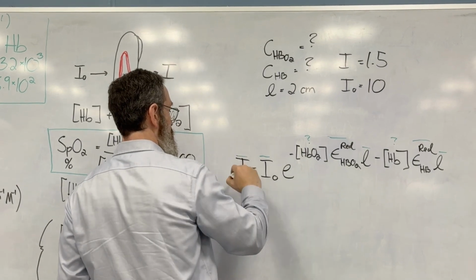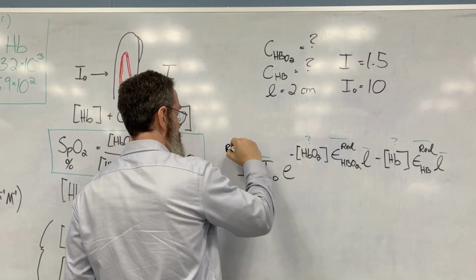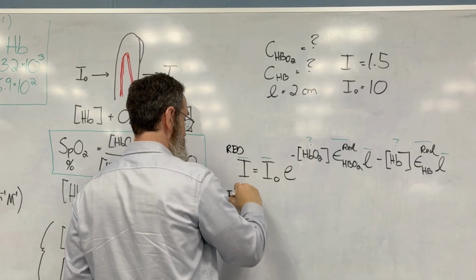And so this, to be clear, was for red light. And so I could do the same thing for infrared.